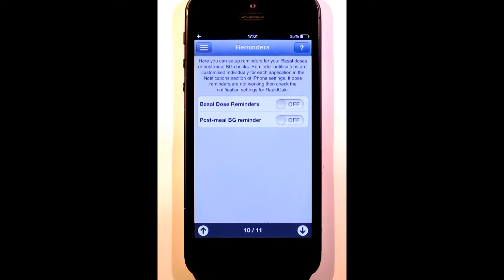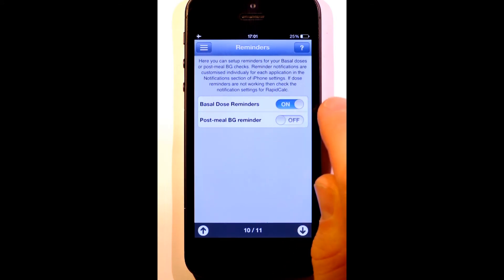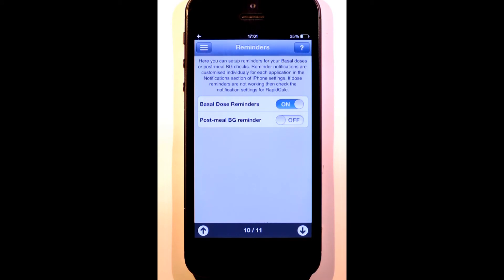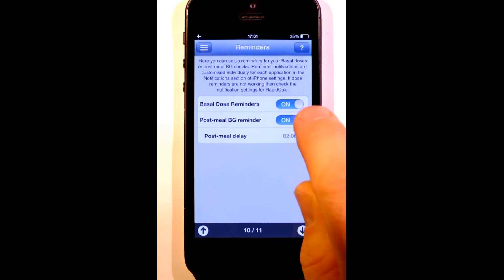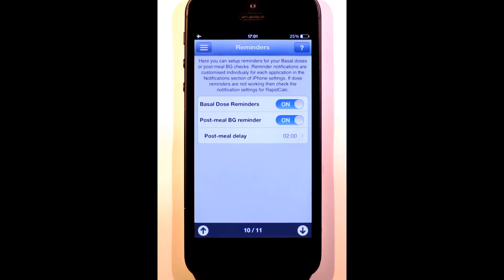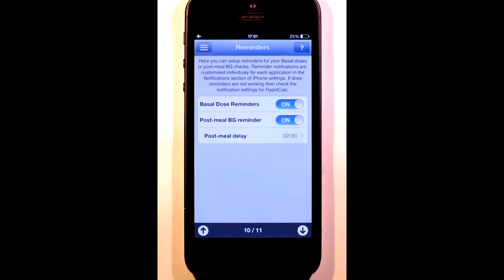Here we have the reminder options. For basal doses, I'll hear an audible alert and see an app badge when a dose is due. The second reminder prompts me to check my blood glucose level sometime after I've dosed for a meal. By default, the delay is two hours, but you can change this.